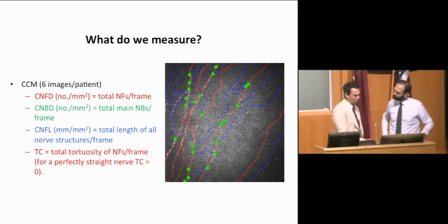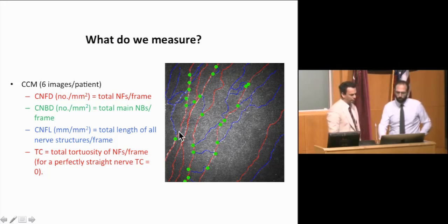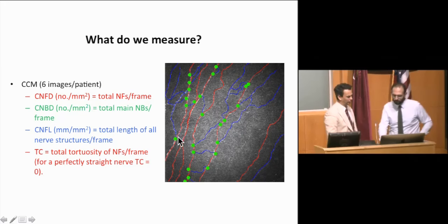One question about the branch, where you measure with the green dots, you only do that on the main fibers, the red lines? Exactly, correct. So we don't measure secondary branches. What I mean by secondary branches, these are branches that are coming off a branch and not a main nerve fiber.